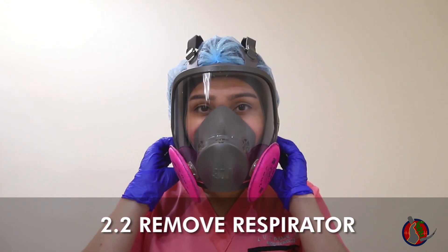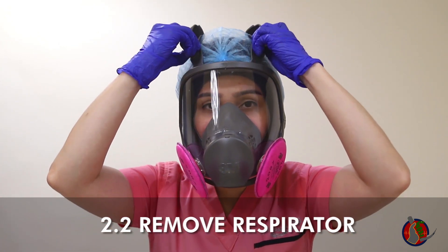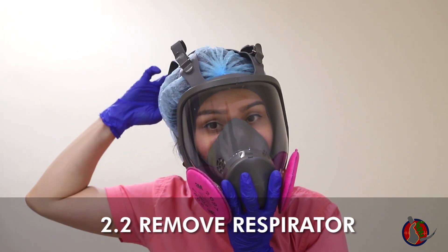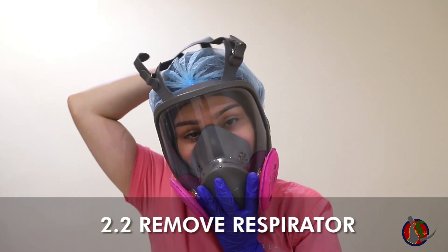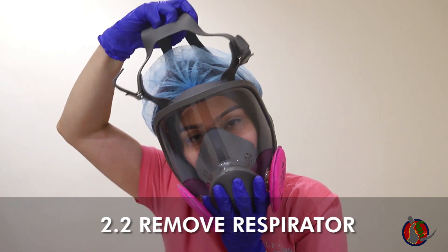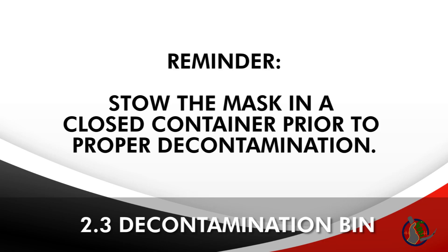For doffing of the full-face respirator, first fully loosen all four head straps by lifting up on the buckles. Then remove the respirator by pulling the straps over your head. You have successfully doffed the respirator. Proceed to the next step in enhanced PPE doffing. Stow the mask in a closed container prior to proper decontamination.